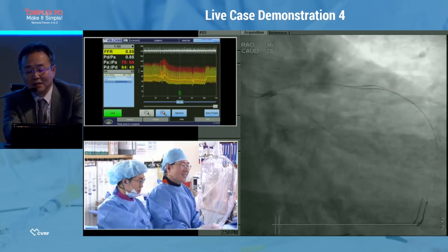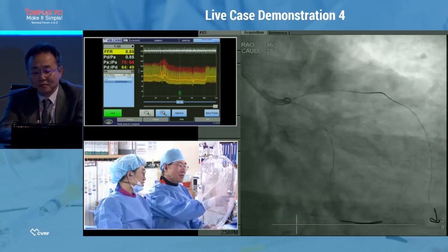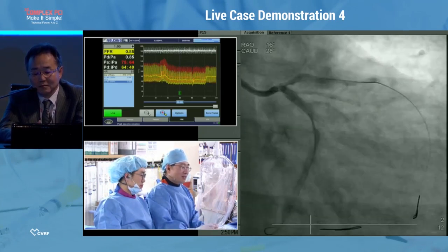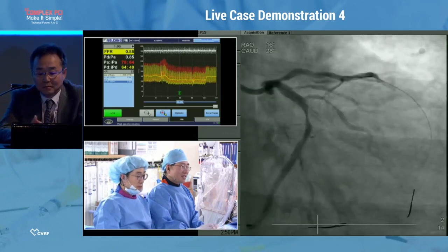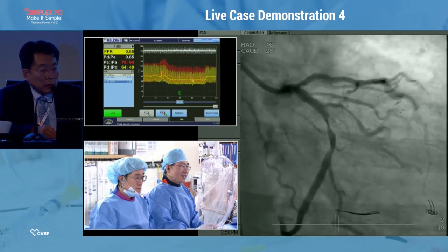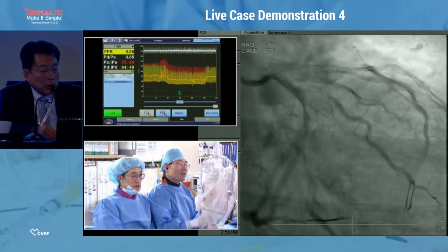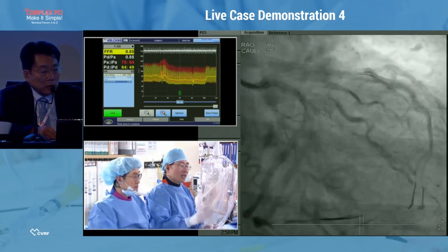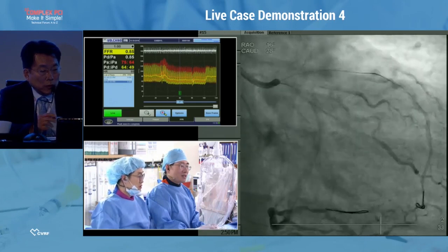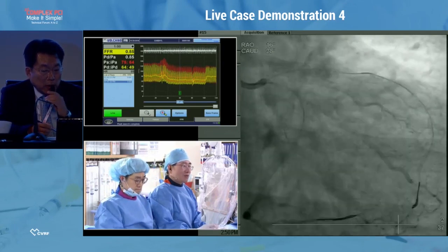I agree. I fully agree, I understand what you mean, but I think when we check the distal part of the FFR, the proximal and distal FFR may decrease to 0.8. Also, Dr. Wong, you don't have any information for this patient, evidence of ischemia, previous FFR? No? You have no idea? Yeah, we don't. We did not do FFR and did not have any stress test before in this patient. Okay, so what would you do? You want to try the stent for that, right? Yeah. Okay. Left main. All right. It's best to focus on the left main in this case.